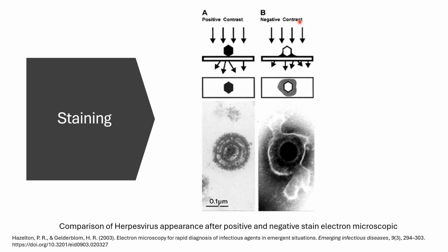Negative staining overcomes this problem by staining the background and leaving the virus relatively untouched. The negative stain is molded round the virus particle, outlining its structure, and is also able to penetrate between small surface projections and to delineate them.